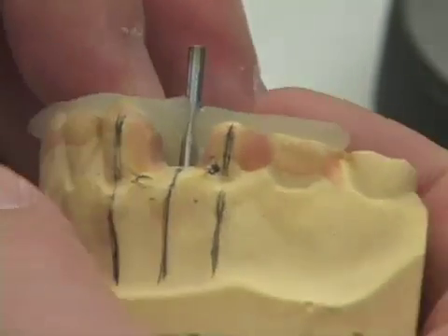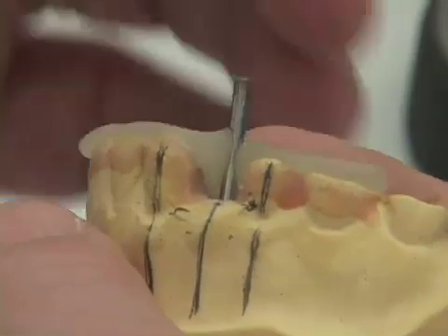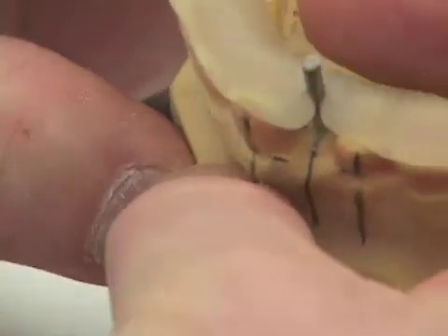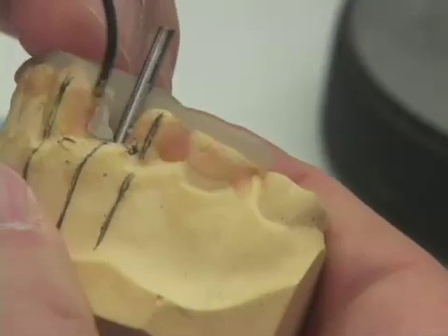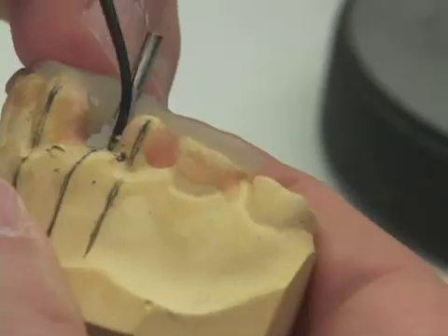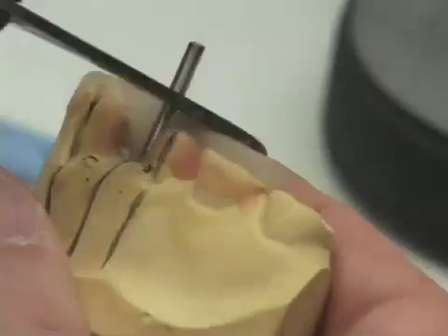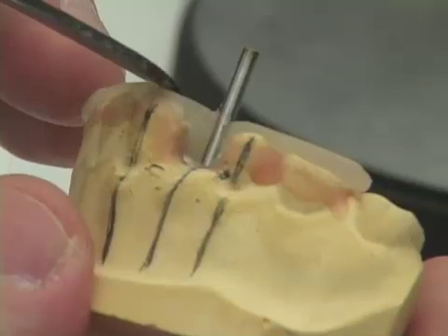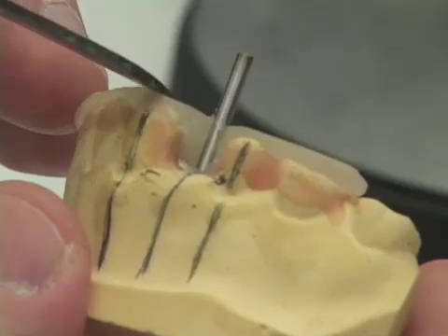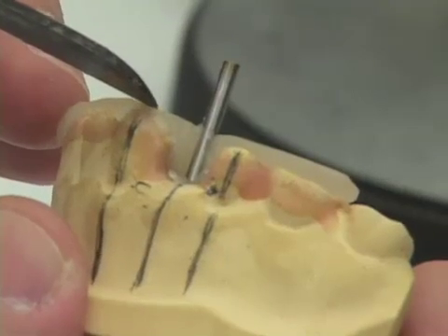One of the tools that's very nice for achieving this is the large Peter K. Thomas instrument. I take my finger and just brace the lingual aspect of my drill guide, and mold the triad material so that I'm sure it gets a real nice adaptation for the lingual 180 degrees of the drill blank. I don't want my surgical guide to be any taller than the teeth by more than one to one and a half millimeters at the most, preferably less.